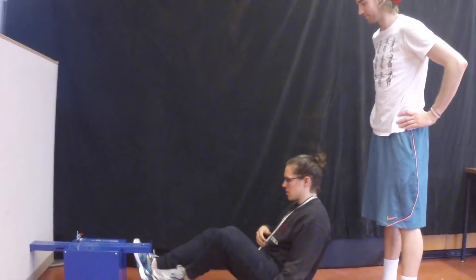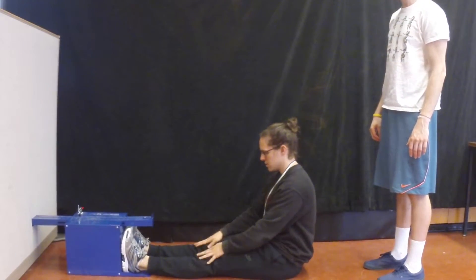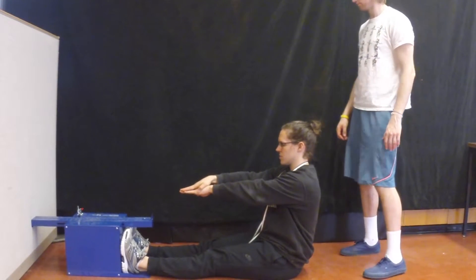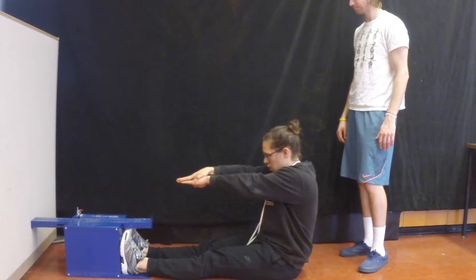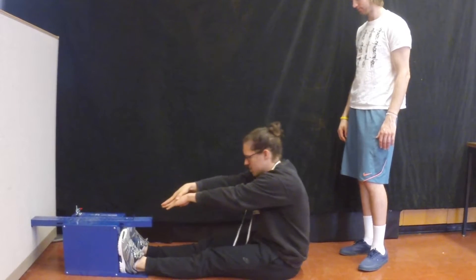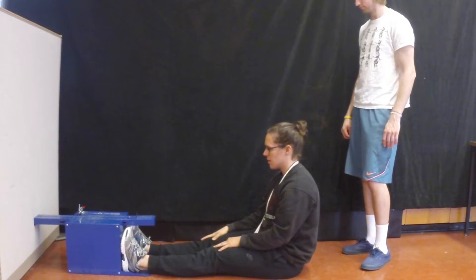Now you may demonstrate the procedure to them. Explain that they must sit down with their legs fully extended and feet flat against the flexometer. Show them how to place one hand on top of the other with their fingers outstretched, and tell them to push the slider slowly as far as possible and hold that position for 2 seconds. As they push, tell them to exhale and keep their head down.